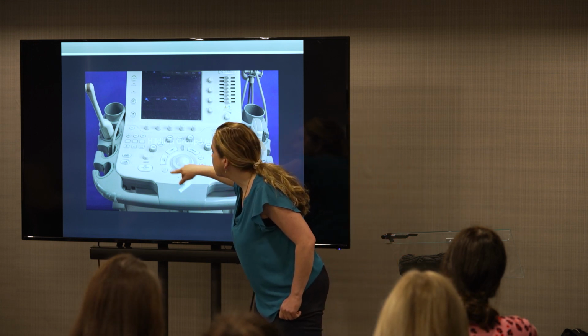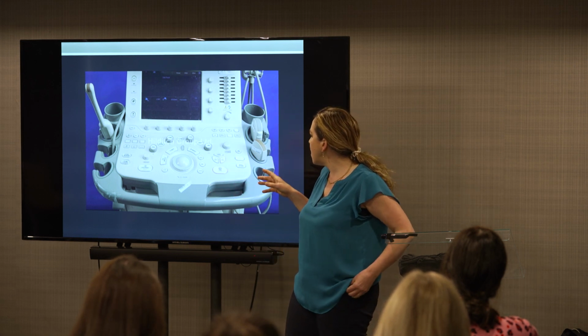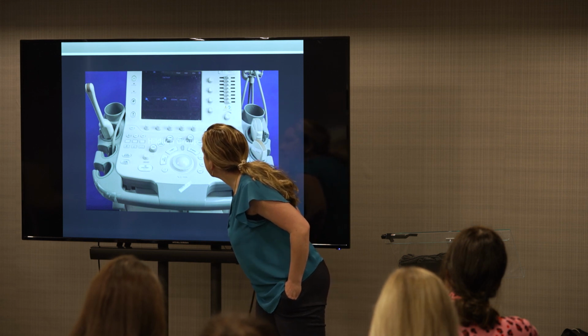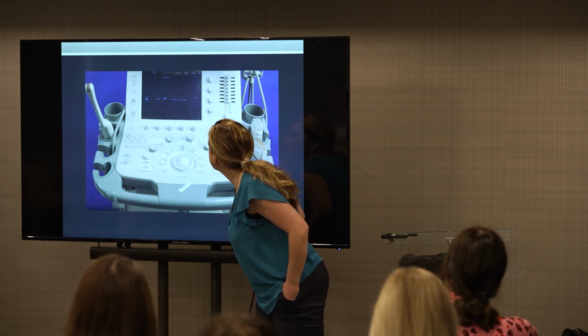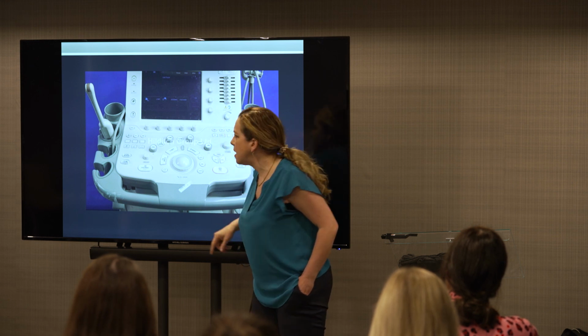Body mark, so make sure you've got the right side. You make sure it's right, left, wherever you're scanning. And I think that's probably about all I use. That's it. Time gain compensation there. Next slide.